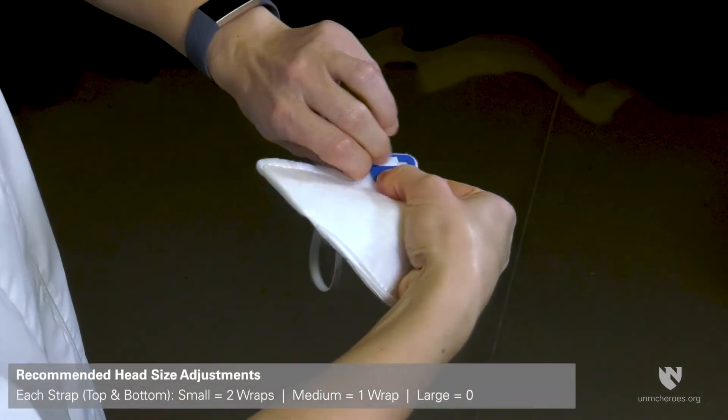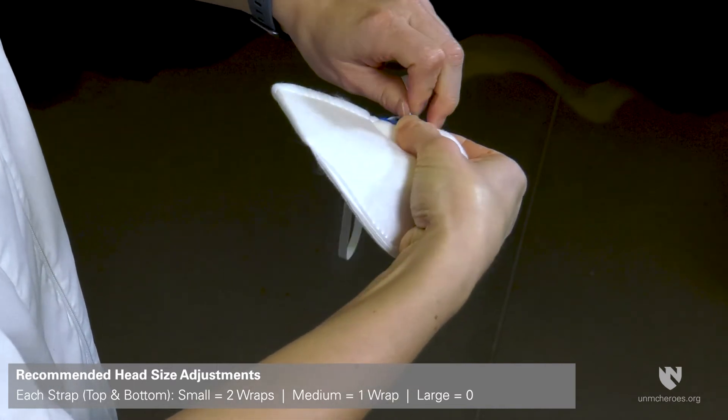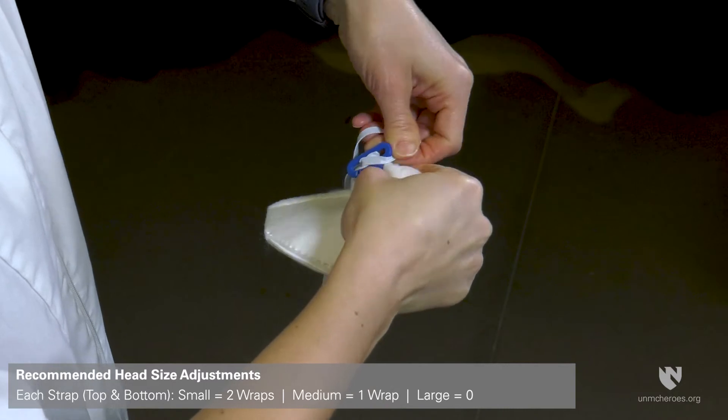Recommended head size adjustments: two wraps for small, one wrap for medium, zero wraps for large, for each strap top and bottom.